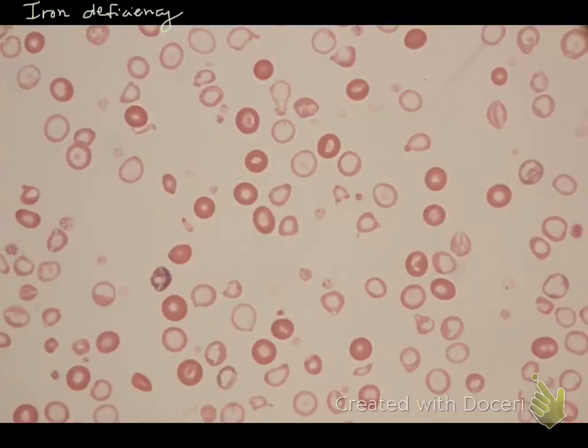I just wanted to show you a couple of slides of what iron deficiency actually looks like on a blood smear, because it's exceedingly diagnostic and you'll look absolutely brilliant if you're the one diagnosing it.